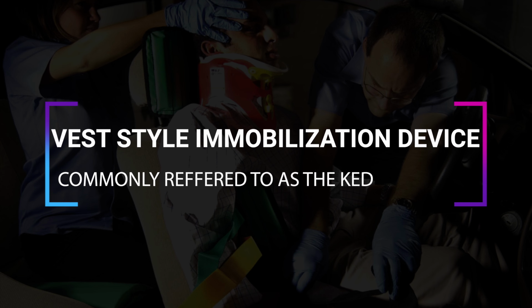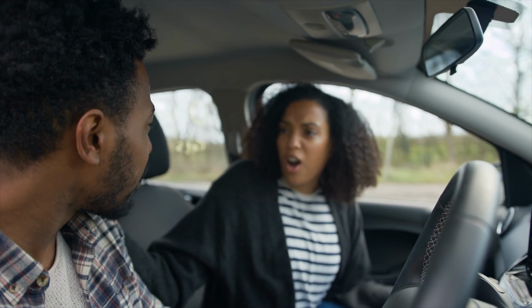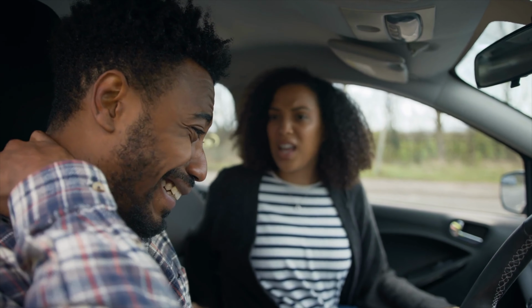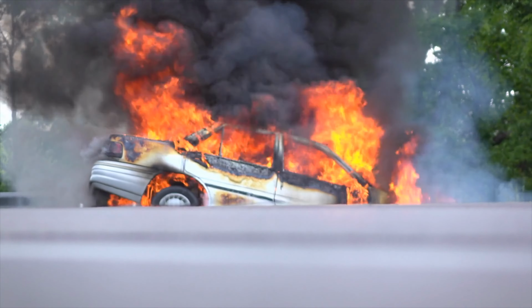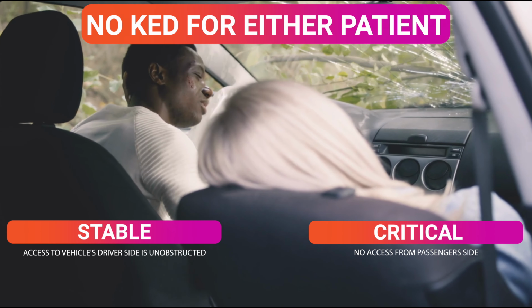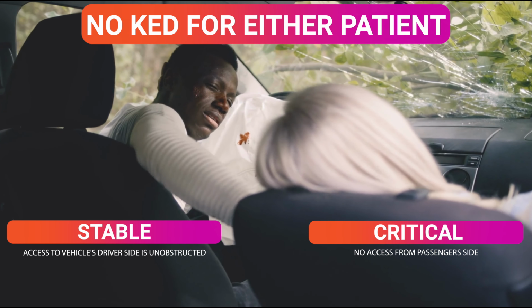The vest-style immobilization device, more commonly referred to as the KED, is unique in that it should only be used on stable patients. The KED is also contraindicated in patients who require an emergency move due to an immediate safety threat, for example, a car fire, or if a stable patient needs to be moved because they are blocking access to a more critical patient in the vehicle.